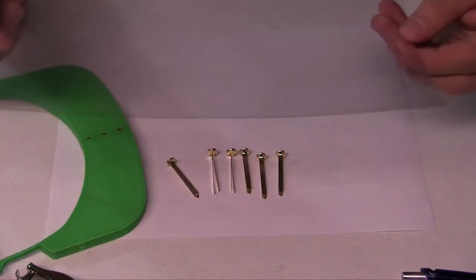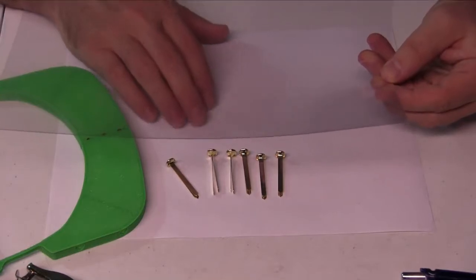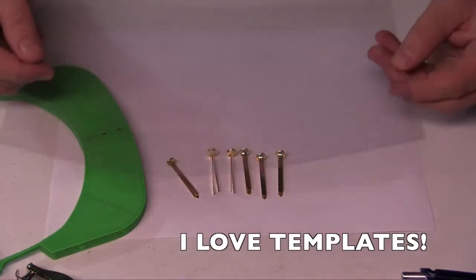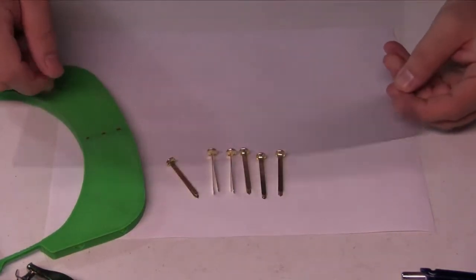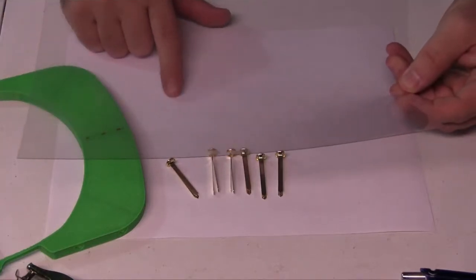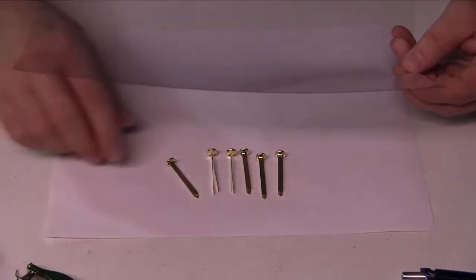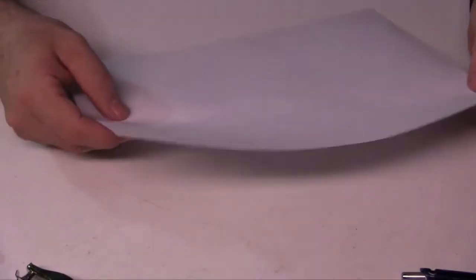And we have our plastic sheet, and we're going to be using this little piece of paper. I'm going to show you how to create a template so that, rather than holding this up to the frame in order to make the holes, you can actually mark the holes using this template. So let me demonstrate that right now. We'll set this all aside, and now we're looking at a blank piece of paper, approximately the same dimensions as the plastic sheet that we have.